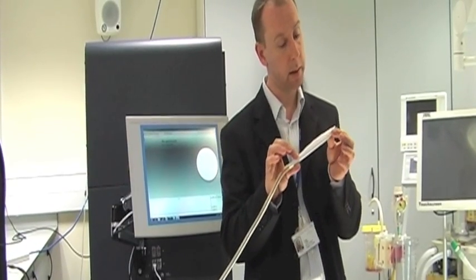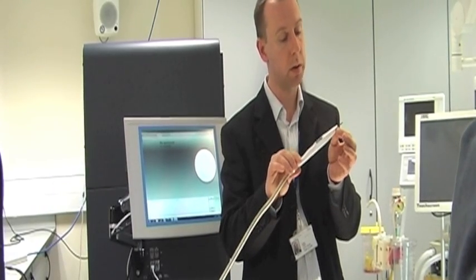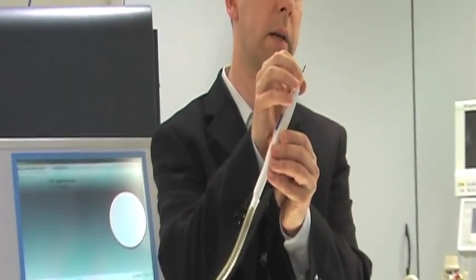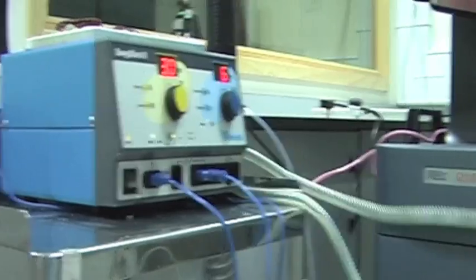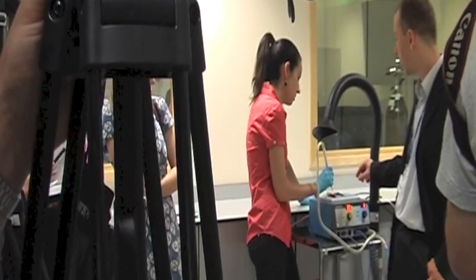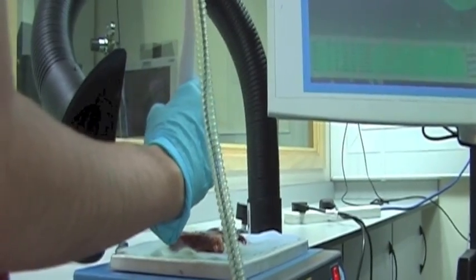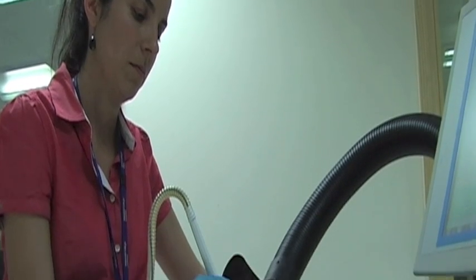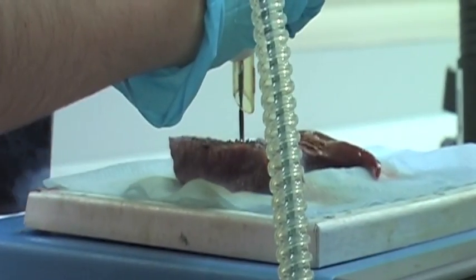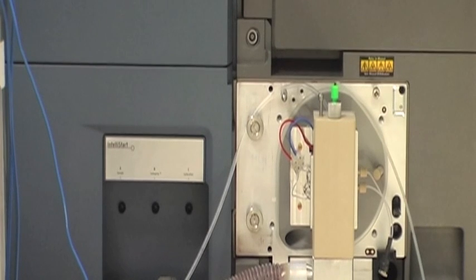The good thing about this handpiece is that it has a smoke aspiration utility. As you can see, there is the cutting electrode, and around the cutting electrode this handpiece can aspirate. It makes a great difference because at the moment the surgeon can't see.